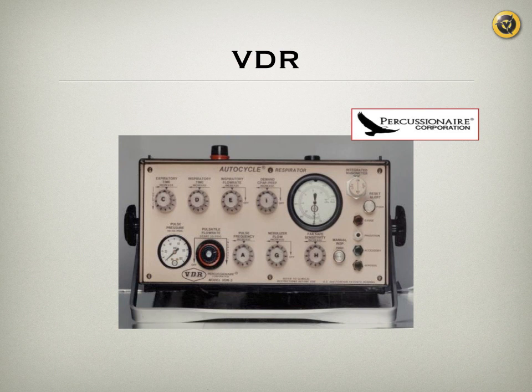And there is no monitoring. I mean, you can see that monitor that you saw the graph of, but that doesn't tell you anything. It doesn't tell you what the minute ventilation is. So all you do is send a blood gas, follow the results, and adjust the vent accordingly, because the monitors don't tell you exactly what's going on.